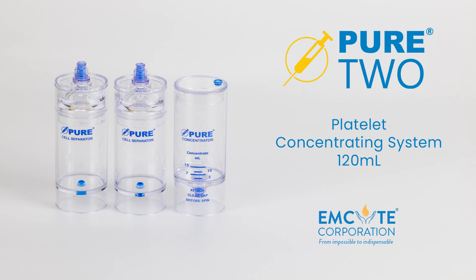Welcome to the next generation of Pure2. In this video, we will prepare platelet-rich plasma with the ease and accuracy of Pure2 120-milliliter platelet concentrating system.